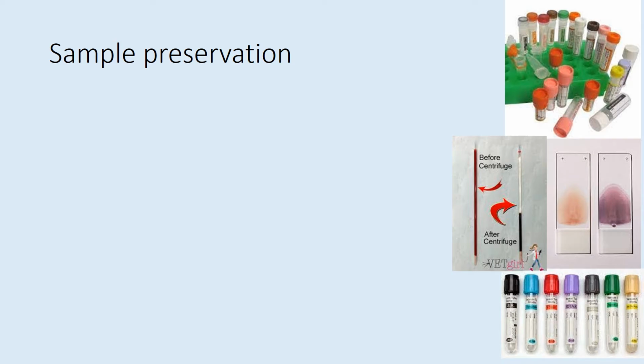Once the blood sample has been obtained, we need to make sure that we contain it in an appropriate setting. For example, we might use a blood container, which you can see in the top right corner here, or a vacutainer. I mentioned it on the previous slide, and that will depend on what the practice uses. The ones at the bottom right of the slide are the vacutainers, which work on suction, and the ones at the top are the containers with the screw-on or click-on lids.